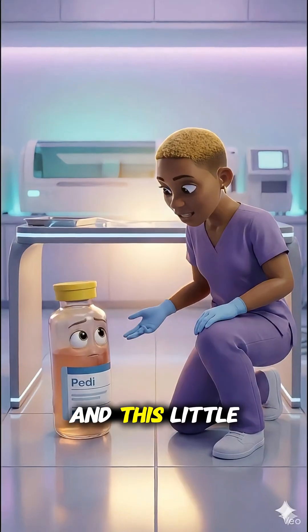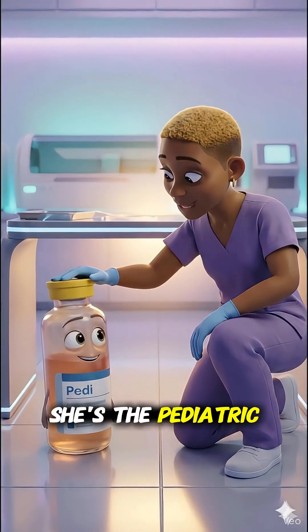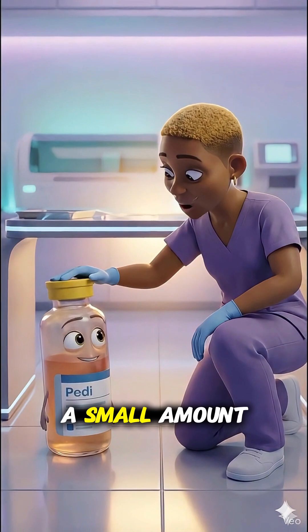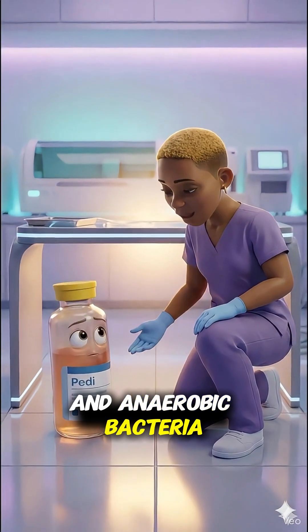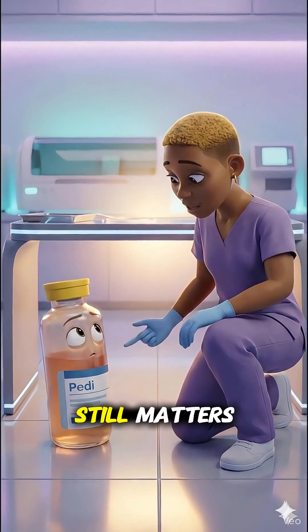And this little one is Petey. She's the pediatric culture. She only needs a small amount, but she looks for both aerobic and anaerobic bacteria. So even though it's less, it still matters.